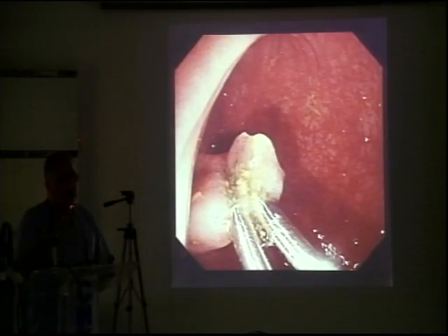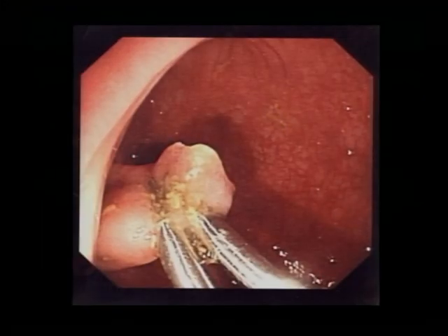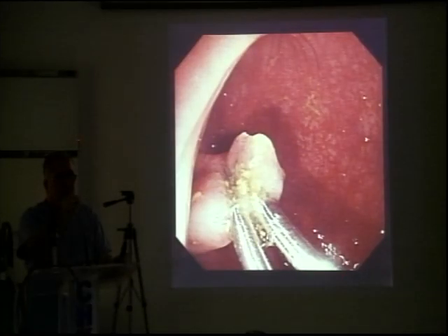Now the ones that just open, as you open, that's forceps, and then close to fire, and it makes a clip sound, some people say release. That's still got the same device, which is a hook, and it still projects 3 centimeters out. So when I do a clip, I'll say slowly open, advance it on, slowly close, great.